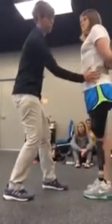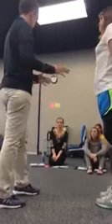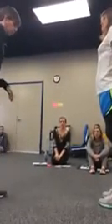So you can see that, and if I'm showing somebody, I like to put my whole hand on, because what you're going to see is it's going to go like this, right, on the hip, as it's rotating backwards and posterior. What we want is we want both to come into the hands alternately, but a lot of times that one disappears, okay? So what does that mean? It means that she's doing really, really well, except we could probably talk her into getting over her toe just a little bit more and bringing that pelvis forward.